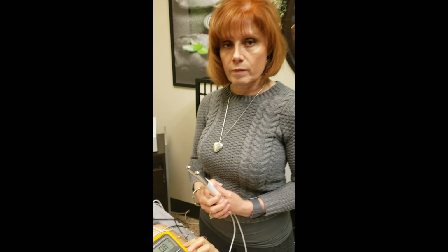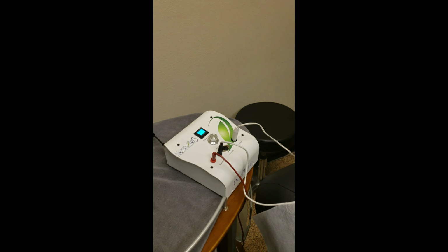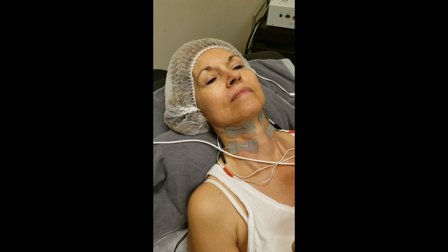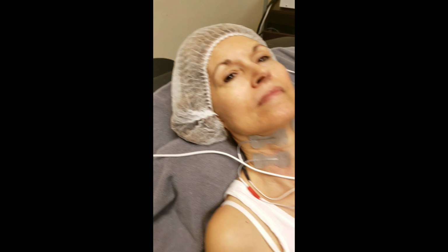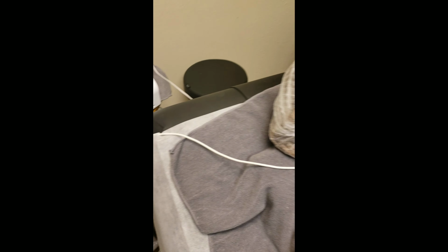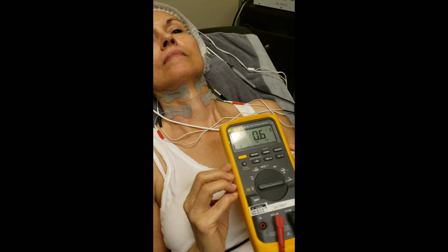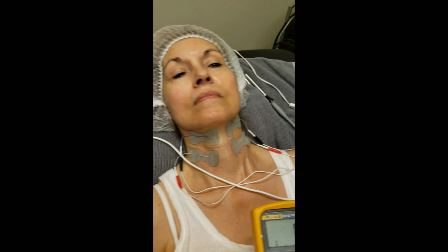Okay, I'm here with Patricia again and Sophie, and now we switch the machines and are using the NEUROTRIS PicoWave. It is a single channel, but it does have multiple ports, and we're hooking it up the same way we did with the other machine to compare apples to apples. One of the ports is connected to the face pads, and the other port we're going to use for the probes. So we're setting the protocols as per the manual for this nano program, and we want to see what current we're going to deliver while we're connecting the face pads to the skin.